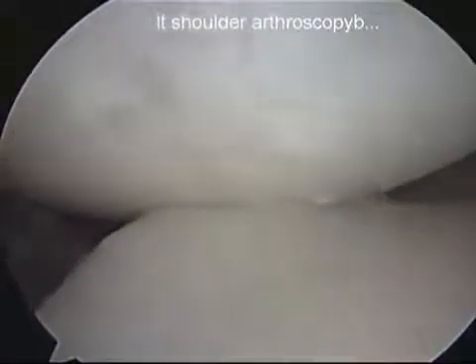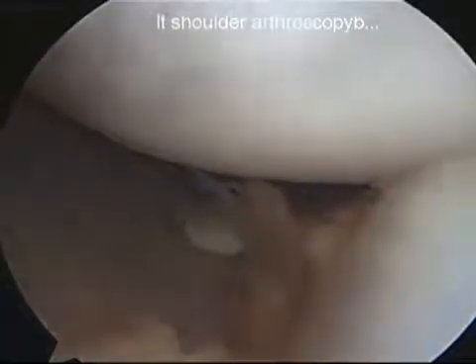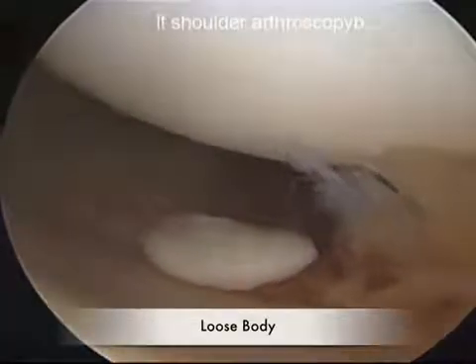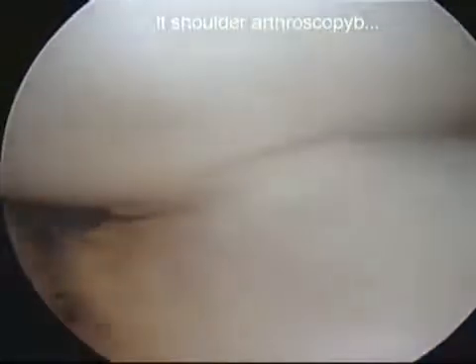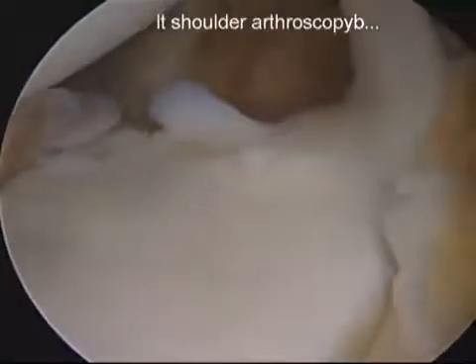Here we are viewing a left shoulder from the posterior portal. The humeral head sits anteriorly and inferiorly from multiple traumatic dislocations. It is easy to appreciate the large patulous anterior-inferior capsule as well as the orange staining of the capsule secondary to recurrent hemarthrosis. Note is also made of a chondral loose body that sits in the axillary pouch.